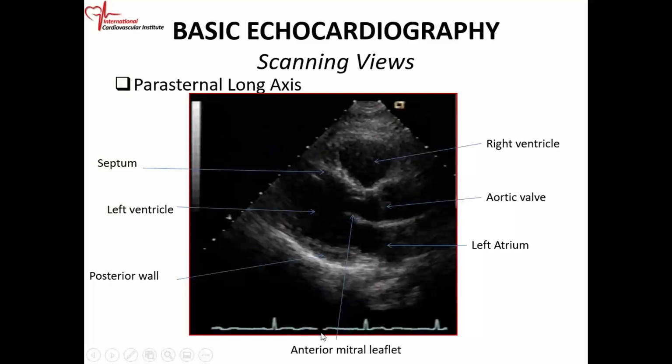So the marker is right here. It's beyond the T wave. This is where it is, and we know that this is diastole. From when you finish your T wave going to the QRS, that's diastole. And we know it's diastole because the mitral valve is open and the aortic valve is closed. Remember, the mitral valve is open in diastole, and the aortic valve is closed.